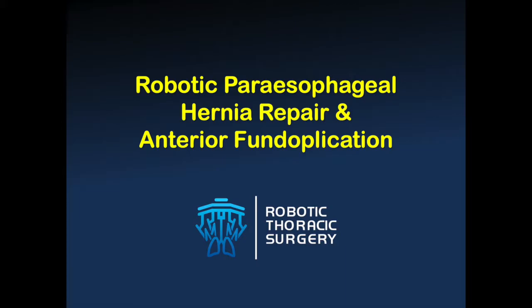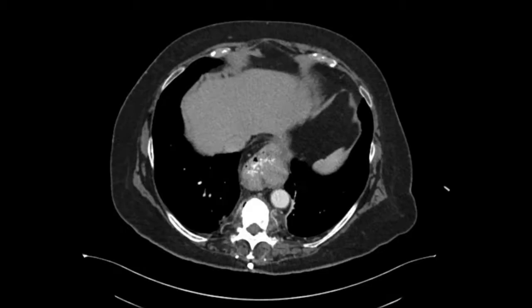As all of you know, there are many ways to surgically correct a paraesophageal hernia. In this video, I'm going to describe my preferred method, which is a robotic-assisted repair with an anterior fundoplication, and I'll try to describe my logic behind my decisions as the video goes along.